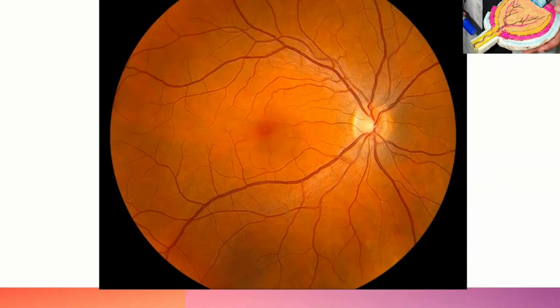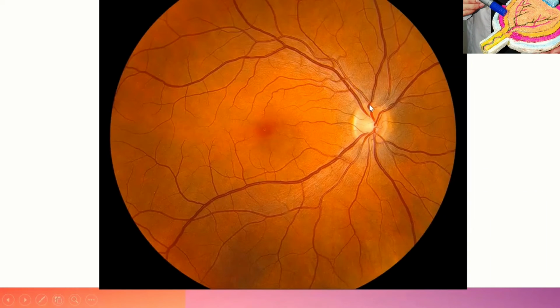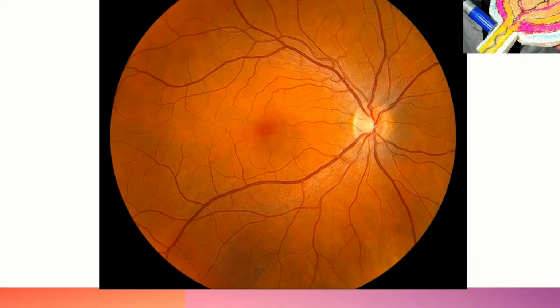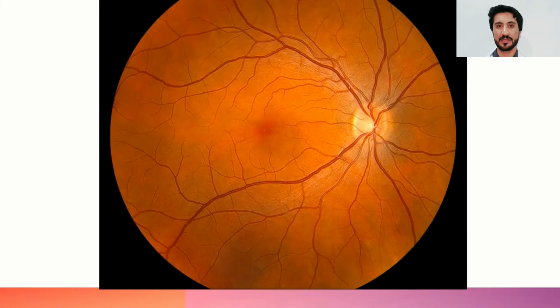So in glaucoma, the ratio of the cup to the disc, which in this case is about 0.4, I would say. The diameter of the cup to the full height of the disc, just under half, do you agree? Thereabouts, 0.3, 0.4, something like that.